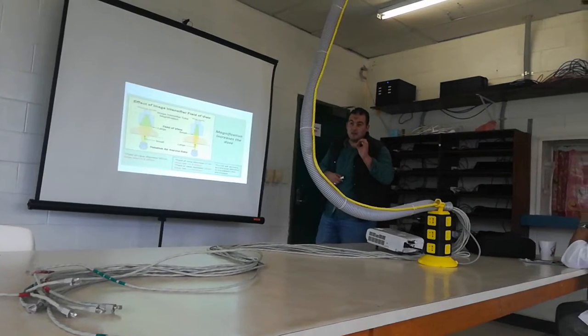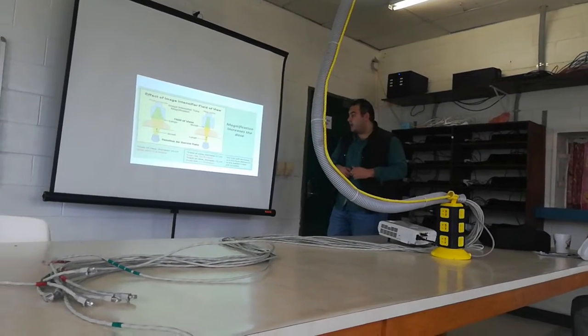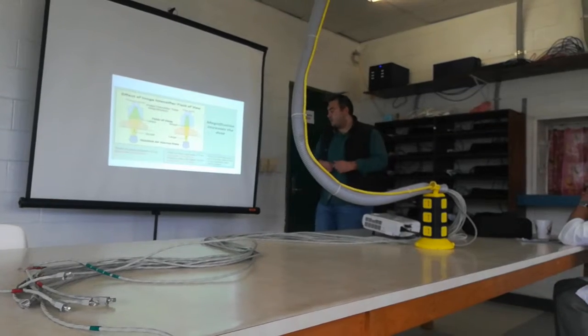So magnification is very important. You have to take care of this point during the exposure of the patient to radiation.